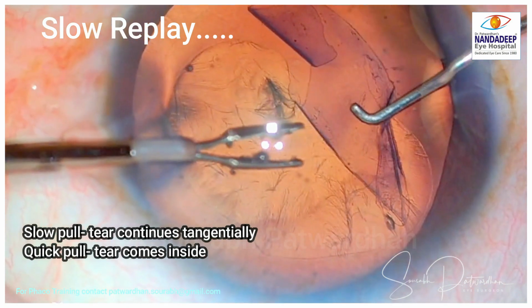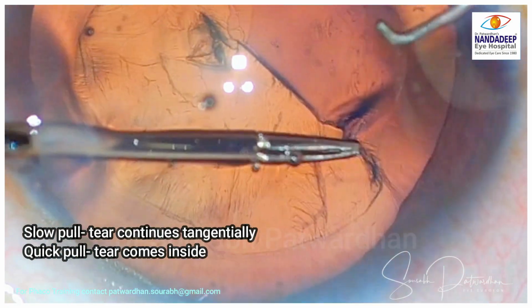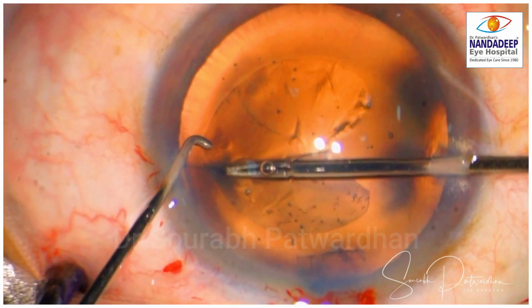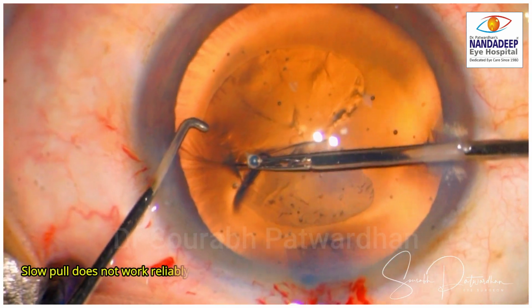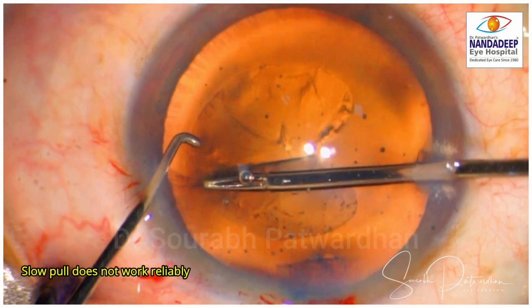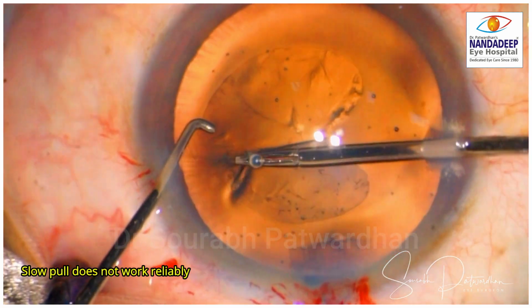So in this technique, it's not just the centripetal pull, but it is also how quickly you pull the tear is very important. So again, to demonstrate how it has to be quick, here the surgeon is trying to gradually or slowly pull the extending tear inside, but is failing to do that.